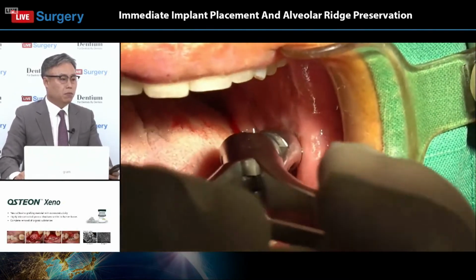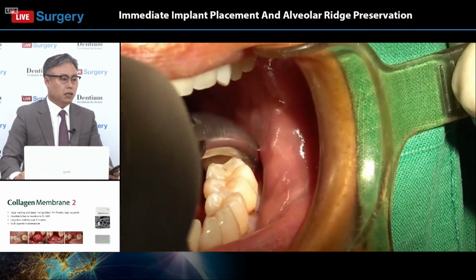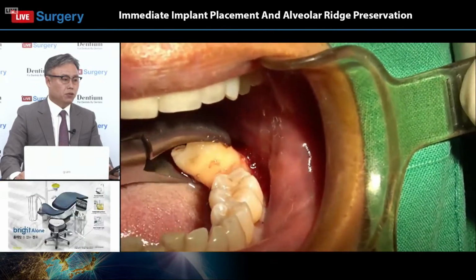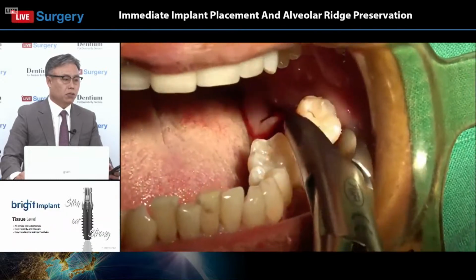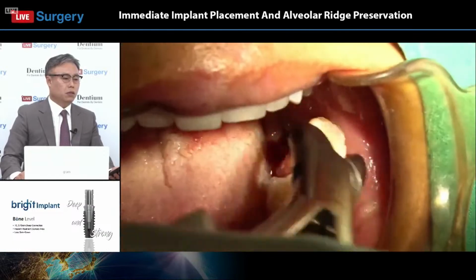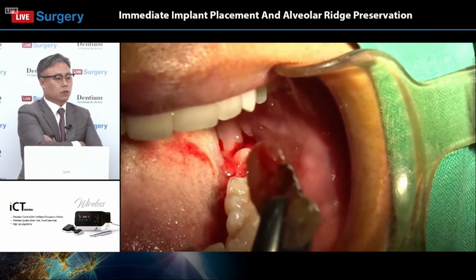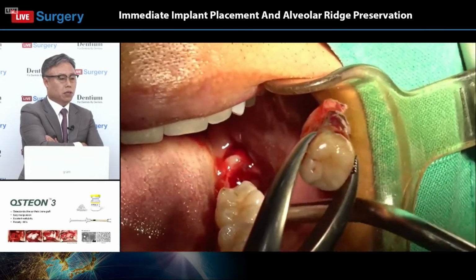As I mentioned, the second molar has to be extracted because of the perio-endo reason. It started with root caries. However, there's a deep pocket on the distal area. If you see after tooth extraction, usually there will be some dental calculus deposit on the distal area. Usually we are using cow horn type extraction forceps. So you see there is some subgingival calculus there.